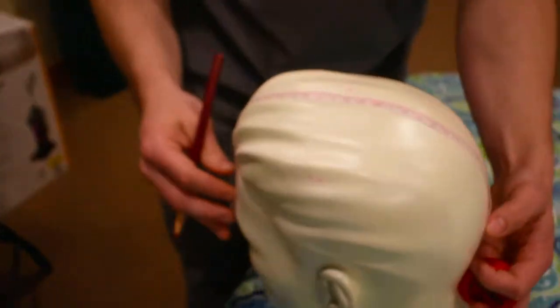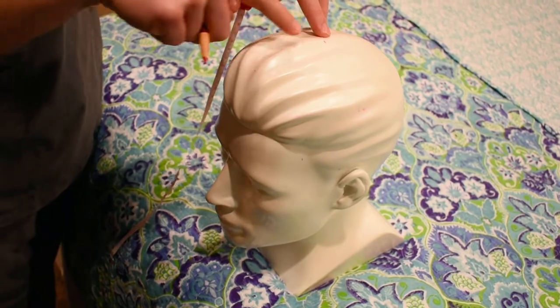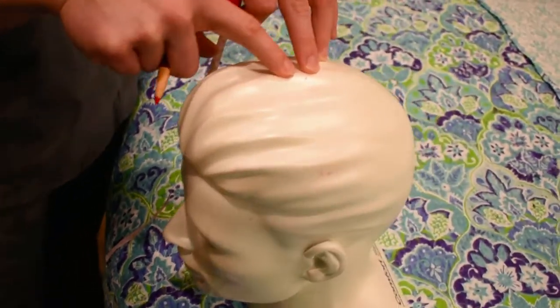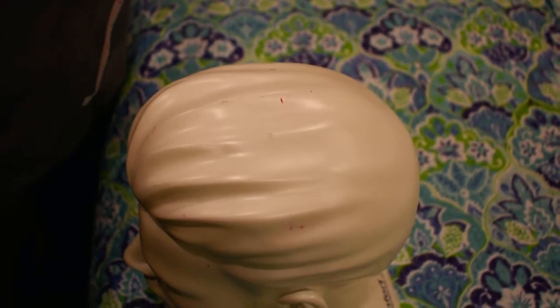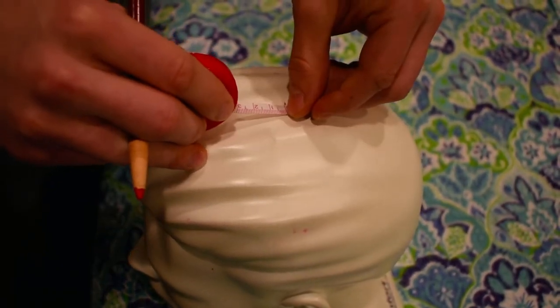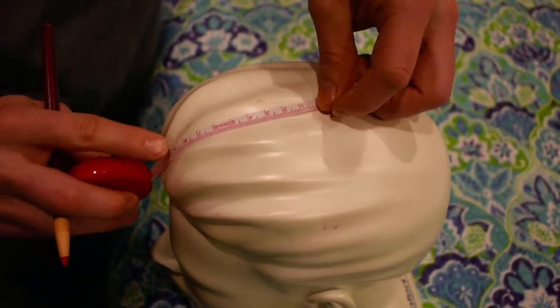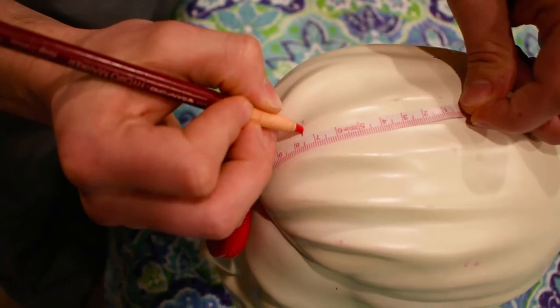And then the last thing that we want to do is measure 20% down from the mark that we made at the top of the head. So 20% of 38 centimeters is 7.6 centimeters. So we're going to go ahead and do that. So 7.6, the marking is going to go right there.